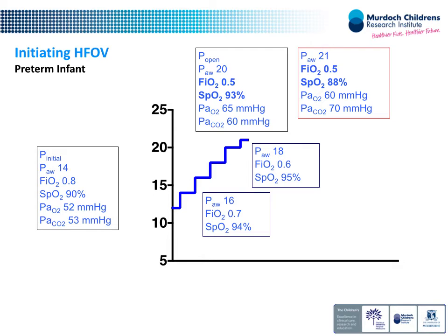We had a Neotrend running in this, which is an old way of getting real-time blood gases from an umbilical catheter, and you get blood gases every 10 seconds. But when I put it up with the Neotrend waveform, people get confused because they can't see it, so I've just extracted out of them. So we now see we're in the same FiO2 and our SATs are dropping and our CO2 is increasing.